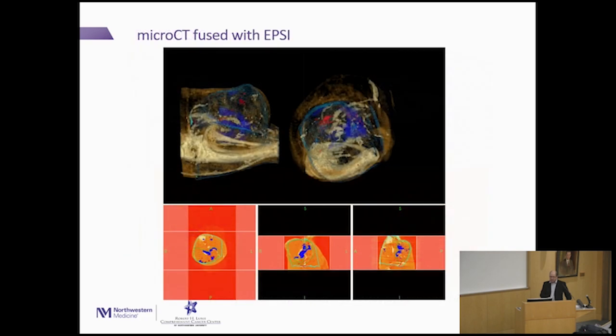And we used a technique with a vascular gel. So this is a terminal procedure. You inject this gel into the vasculature and it makes a cast. And so this is CT now. So the bone and the cast look the same because you're basically filling the blood vessels with something that's radiopaque, just like the bone. So I should have color coded it differently.